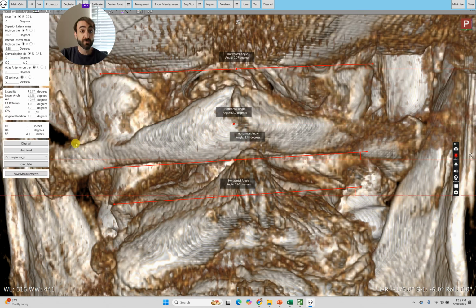And so I could just do it the old way. We take this plane line of 3.5 drawn on that posterior arch, and I'm just going to put that in for both 3.5 and 3.5. And that way we just have one plane line to work with. It's kind of the traditional way of how we measure plane line.